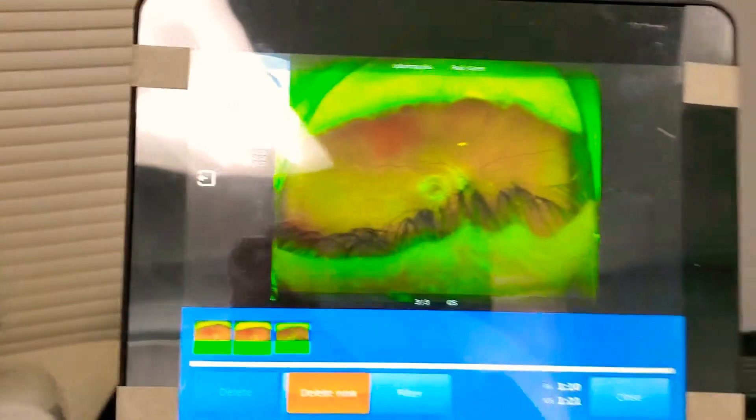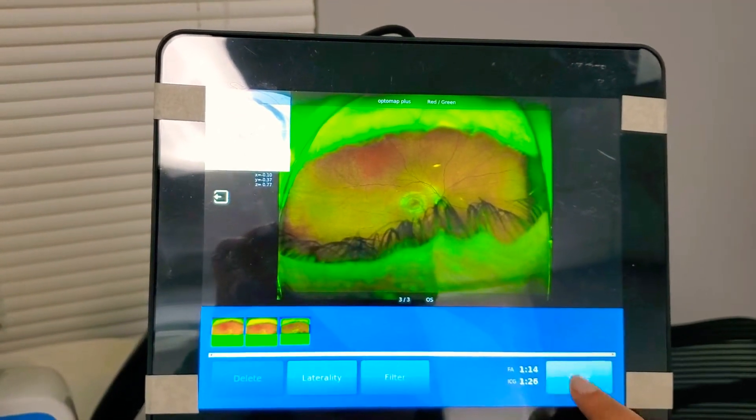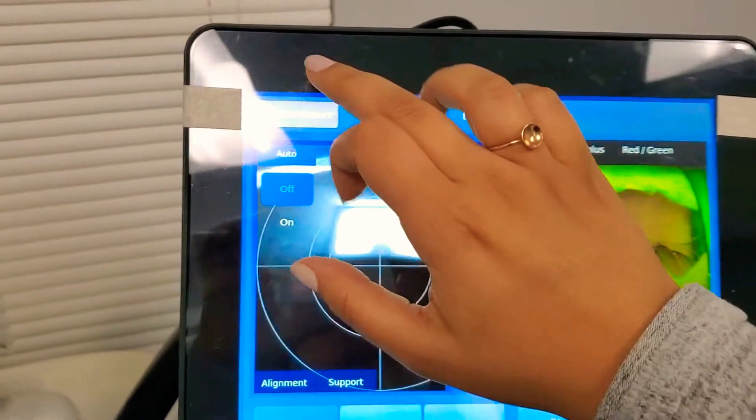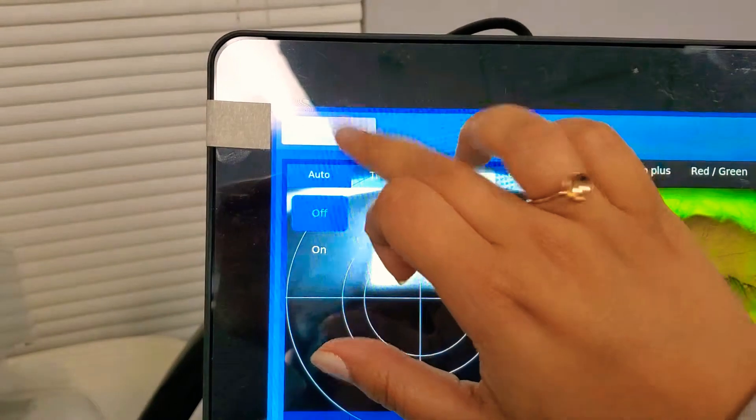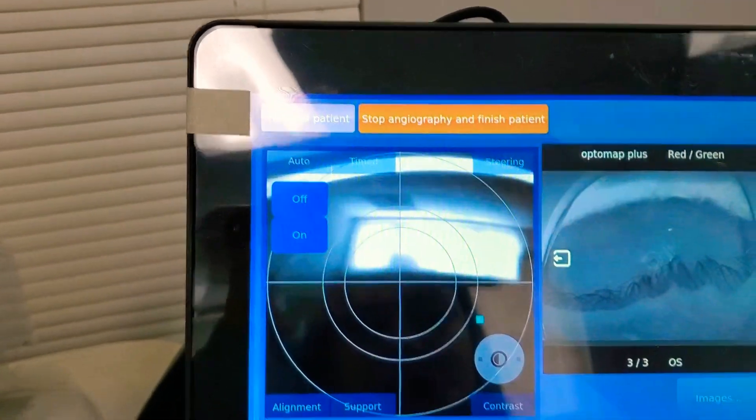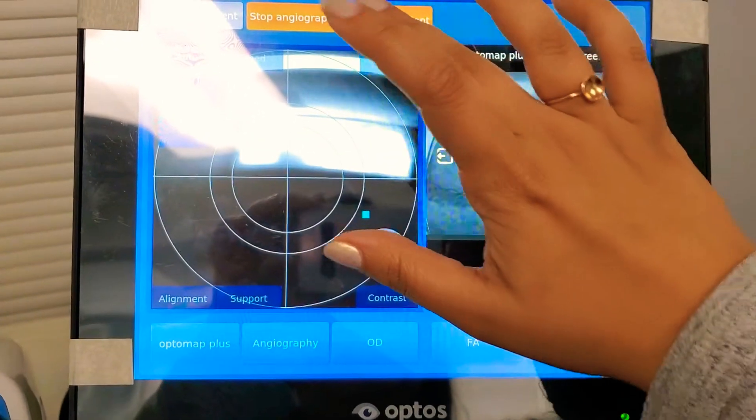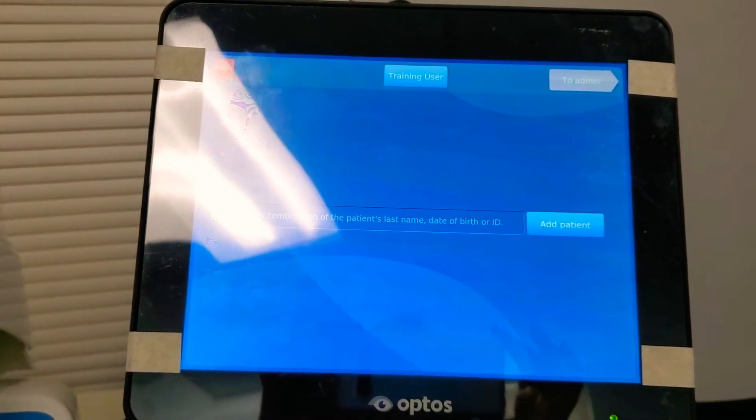And once we're all done. Go ahead and click. Hold on. Close. And we go here to finish patient. Oh. So we have to go ahead and stop the timer for this. Okay. And then from there you go to the computer and it will generate the photos for the physician to see.